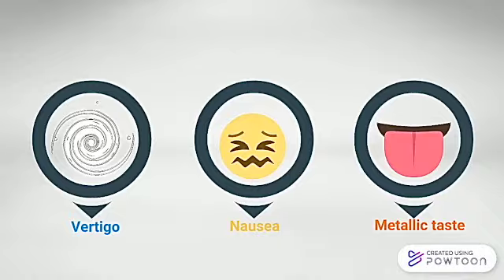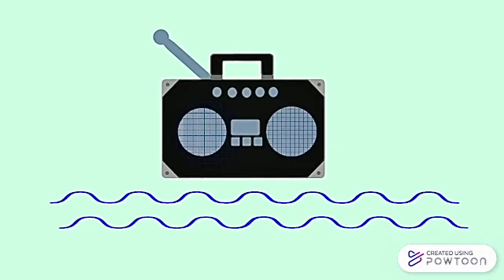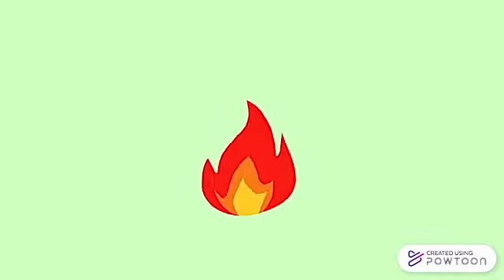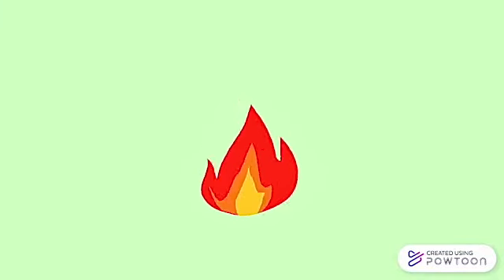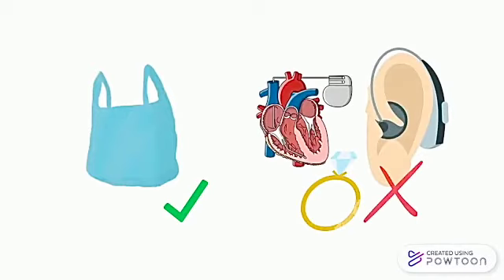The radiofrequency waves, RF, also pose risk to patients as they convert energy to heat and transfer it into the human body. The majority of MR incidents result from the RF, commonly in the form of second-degree burns. Materials such as plastic have no effect during the procedure, but any object containing non-ferromagnetic metal, such as implants and pacemakers, undergoes heating and induction, affecting the implant and burning the skin.